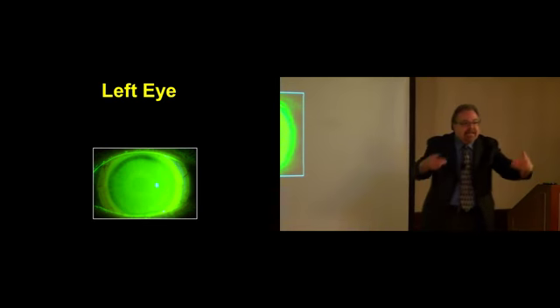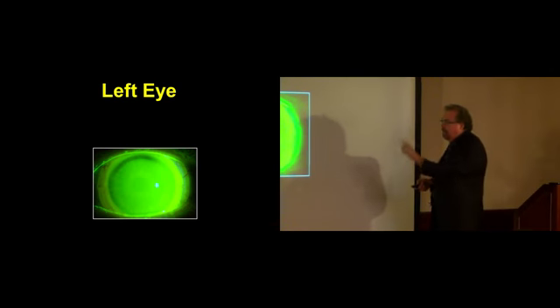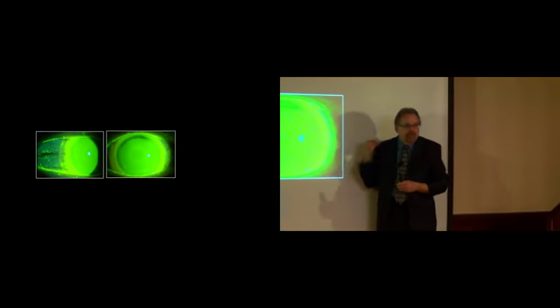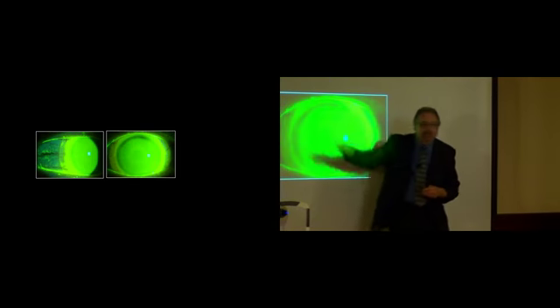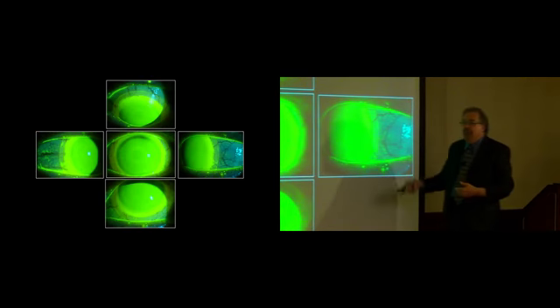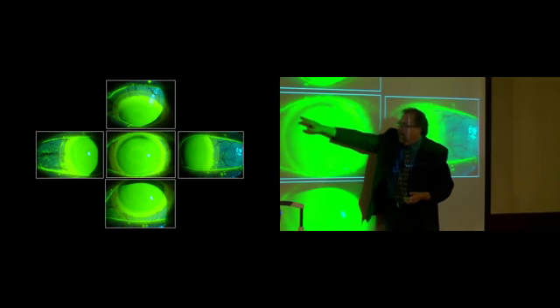We don't need to increase that limbal clearance zone 5 degrees. Because now what I'm going to do is instruct the patient to look over this way towards me, and now we see the lens has great limbal clearance. We have the patient gaze in all 4 directions of gaze, and we see what looked like to be a tight area up there.